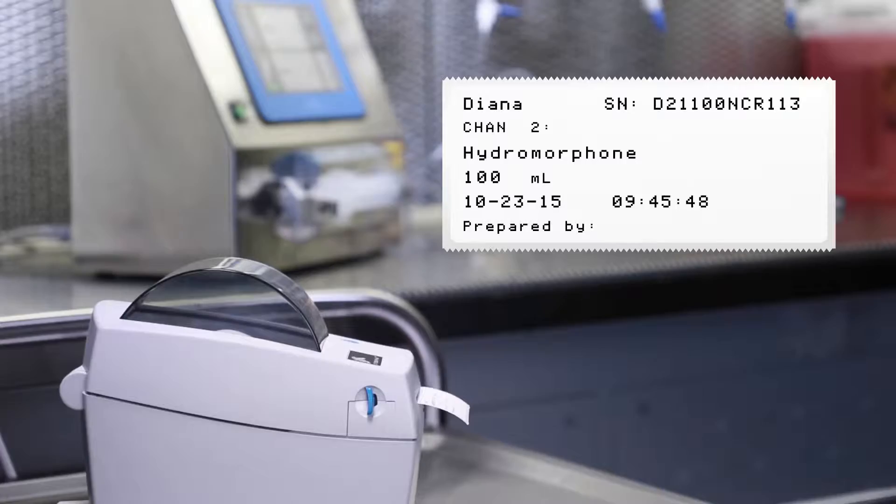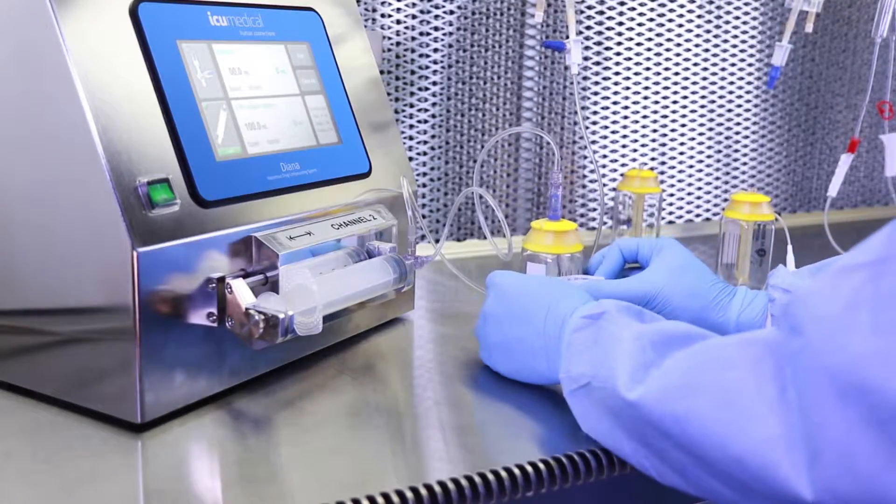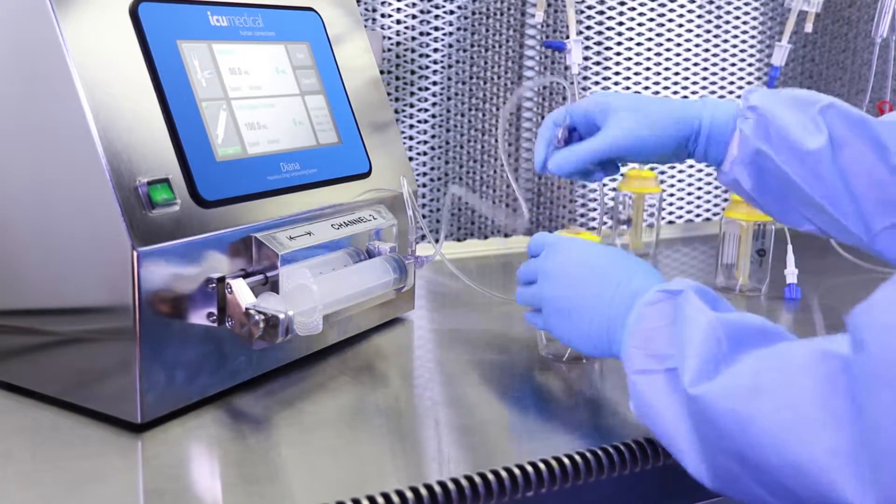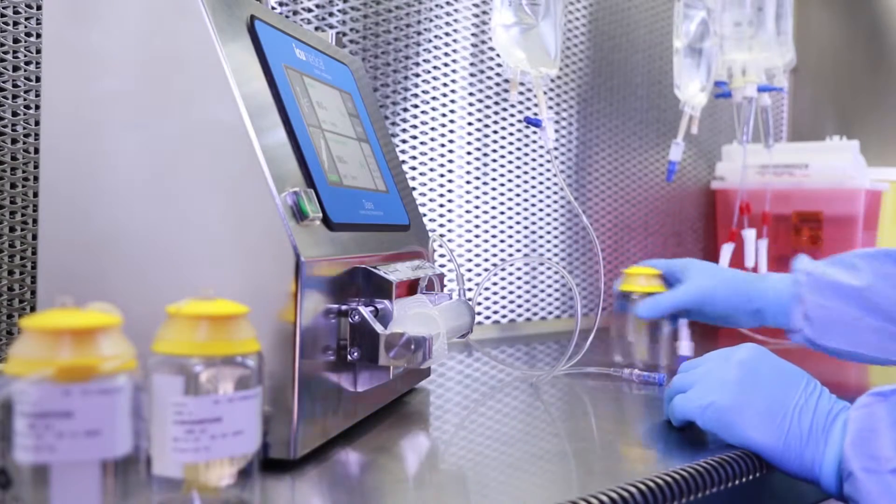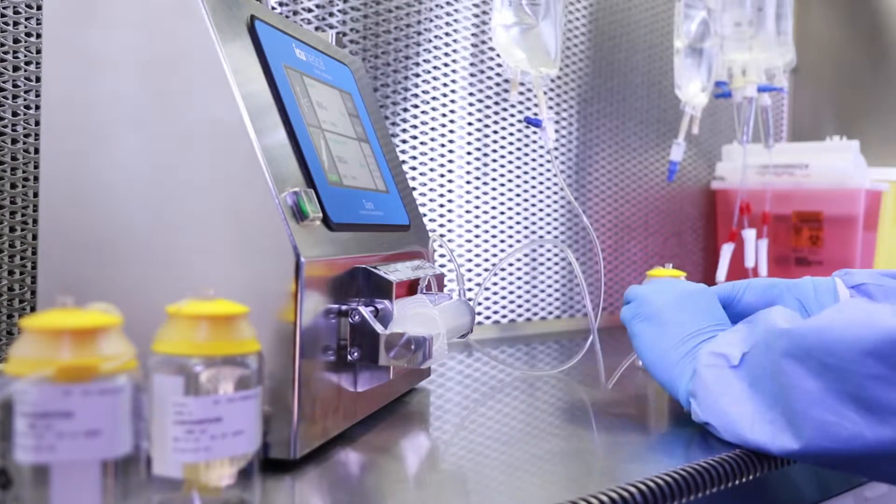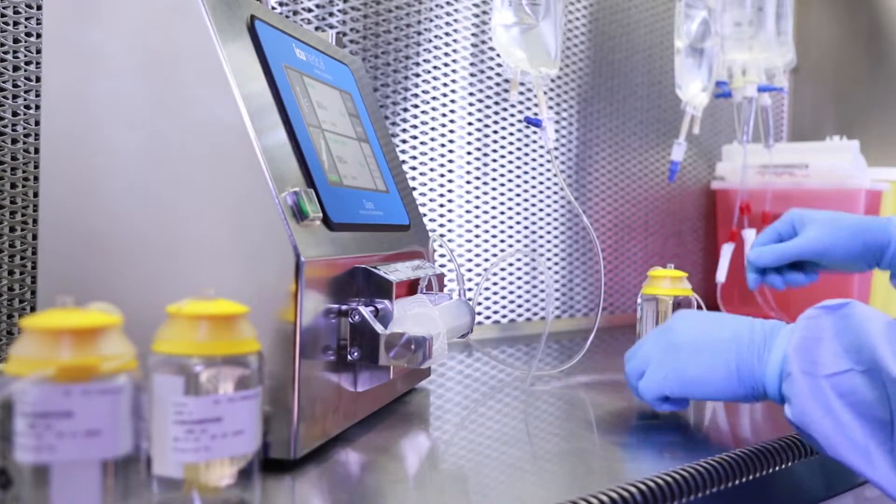When a mix is complete, Diana prints up to five labels to help you verify and keep a complete record of each preparation. When you're done, replace the pump and repeat the process as many times as needed.